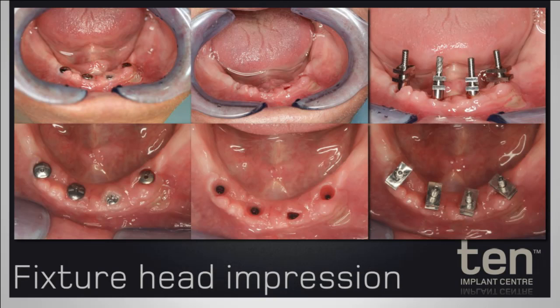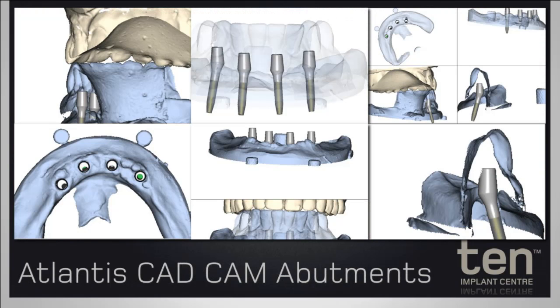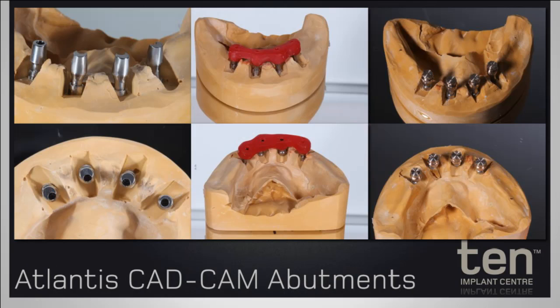These are the implants in place. This is after a period of healing. After a period of healing, we start the construction process in much the same way. We start by taking a fixture head impression, and we can splint the impression posts together. That's what you can see, and we've used floss initially to hold the pattern resin in place. With this impression, we're able to go digital, make the CAD/CAM abutments digitally, and parallel them and position them according to the height within the denture that we need.